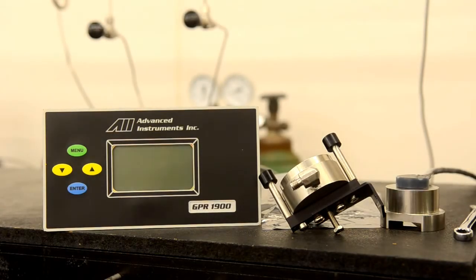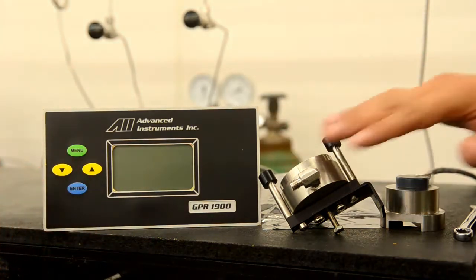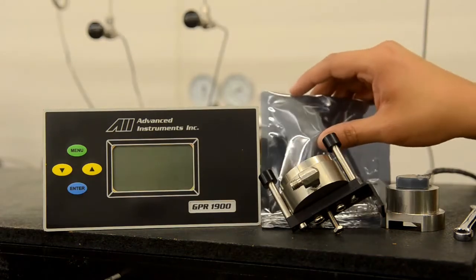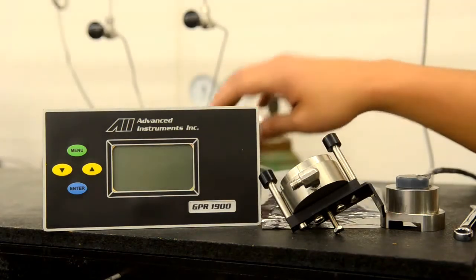When you receive the unit, it will come with the main module, the sensor housing top and bottom, the oxygen sensor purged in nitrogen and bagged and sealed, and the associated cables with the unit.